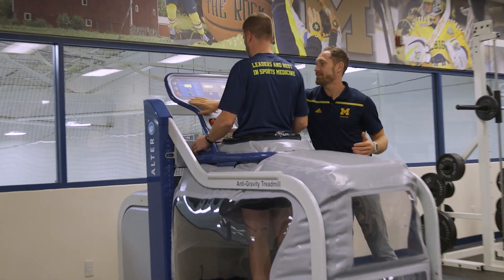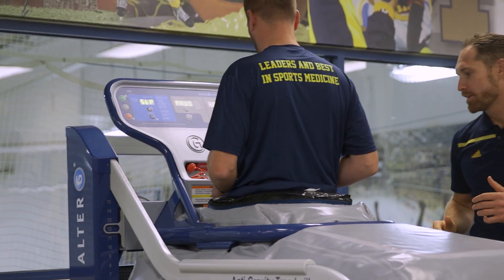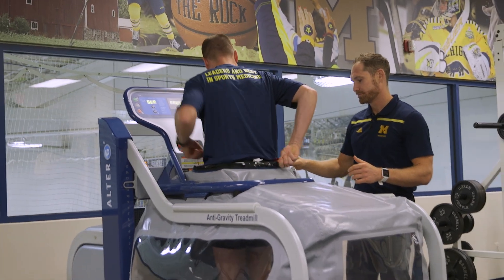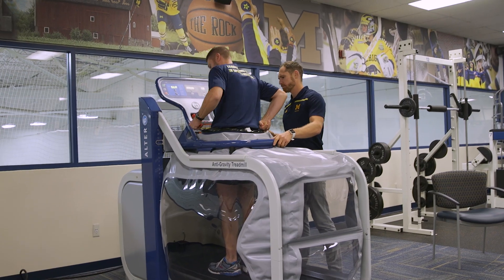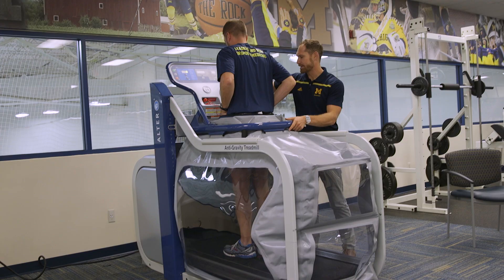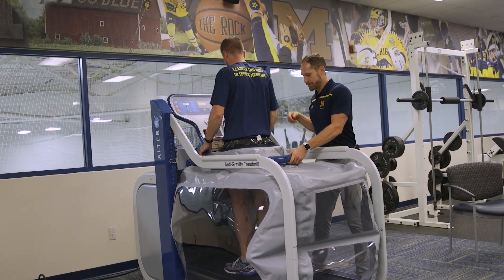At that point, you can shut off the machine by hitting stop. As it deflates, we can unzip, unlock the cockpit, and lower it down.